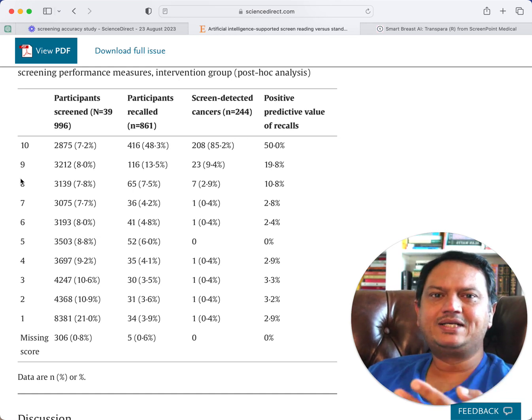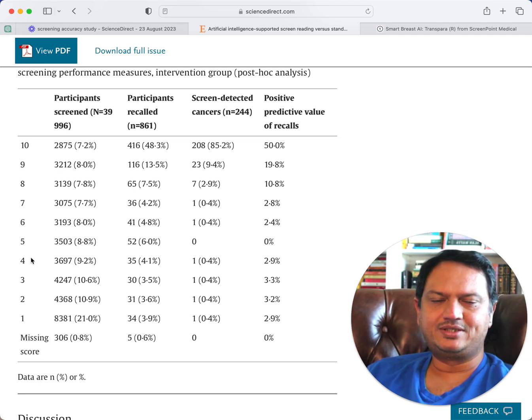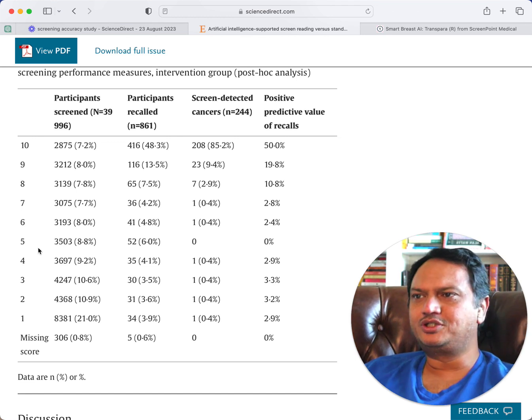But practically speaking, when they are trying to decide what to do with them, they grouped everything into low risk, medium risk and high risk. So I'm still a little puzzled how this score of 1 to 10 is calculated, and is it based on some statistical calculation or formula?